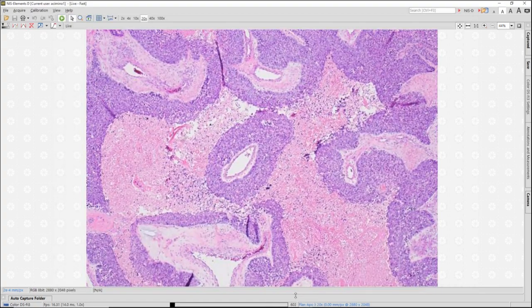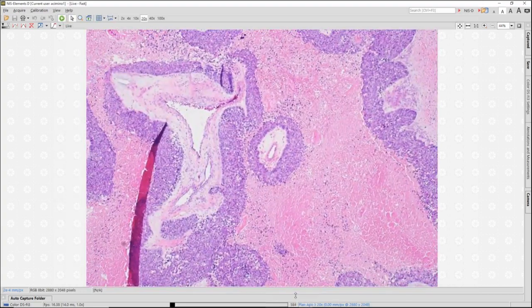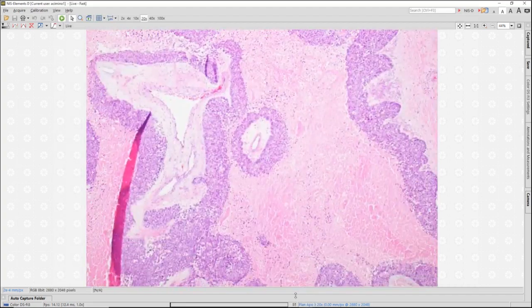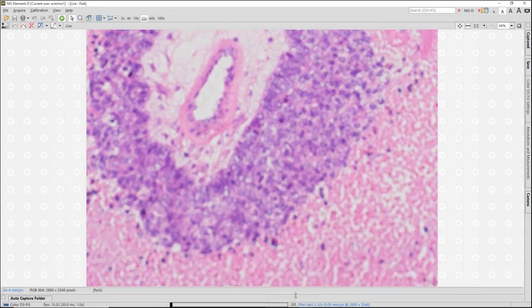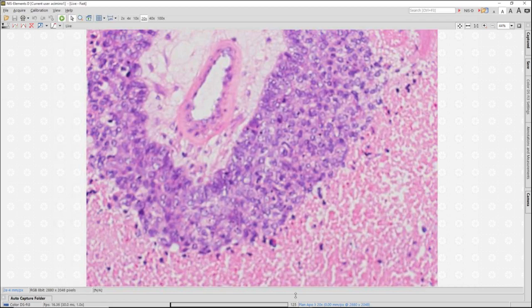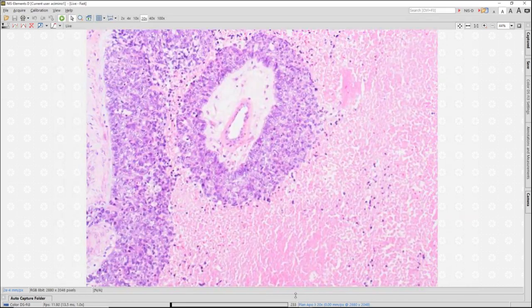This is pertinent largely on core needle biopsy, where you may just get the center area and say, oh, it sort of has a papillary architecture. You don't want to call encapsulated papillary carcinoma because right off the bat, you see high nuclear grade, apoptotic figures, let me focus view, frequent mitotic figures, extensive necrosis.